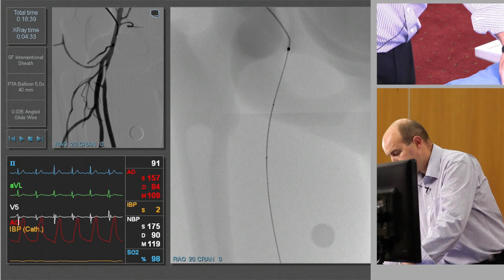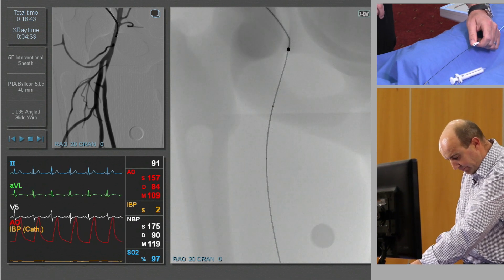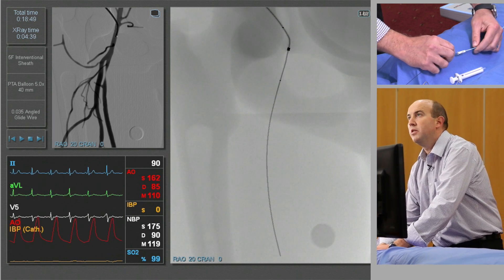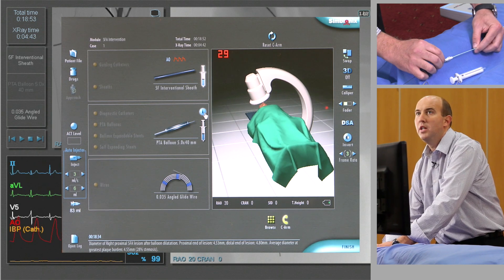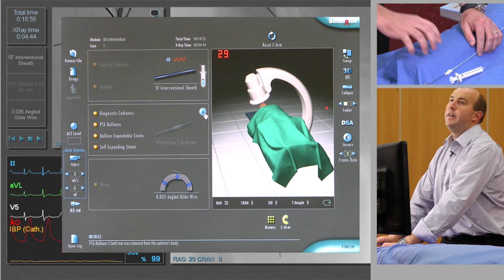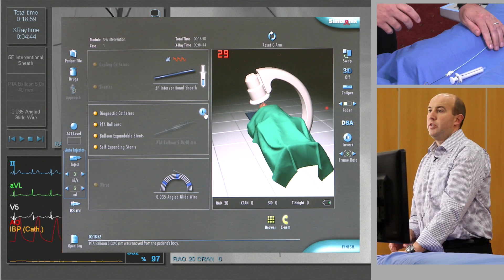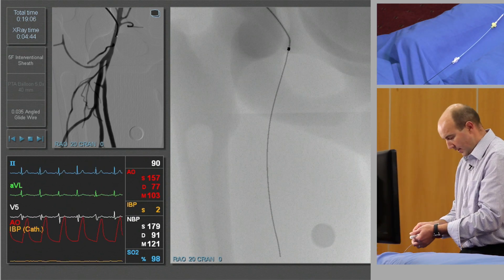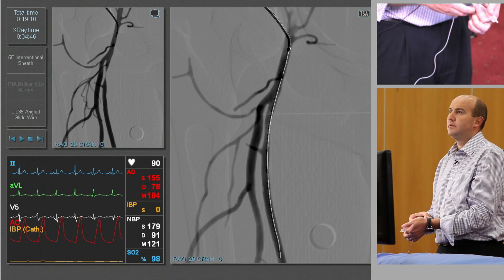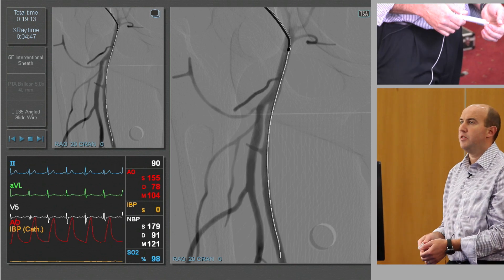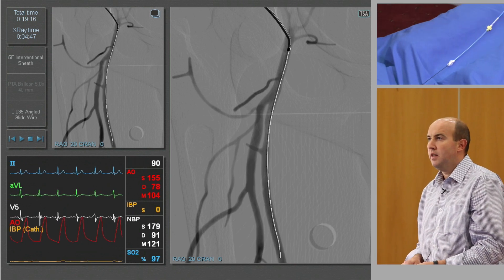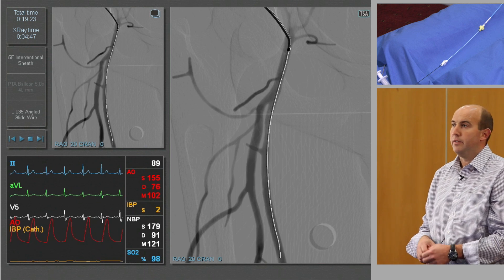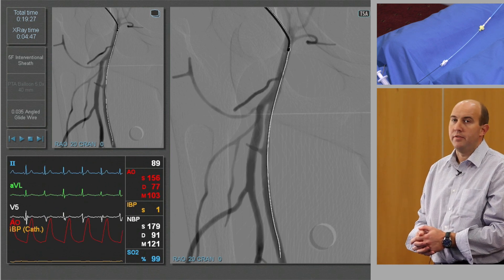Then deflate the balloon — rapid release. Once you ensure the balloon has deflated you can withdraw. Pull that wire back a touch; I don't like the wire going off the screen. Withdraw the balloon leaving the wire across the lesion at all times. Now it's disengaged from the system, so we'll do a check angiogram with the wire across the angioplasty segment — this is just a DSA run. And there you see a successful angioplasty across the SFA segment. That completes the treatment. The only thing else to do would be a below-knee run just to ensure that you haven't caused any iatrogenic injury — a successful SFA angioplasty.